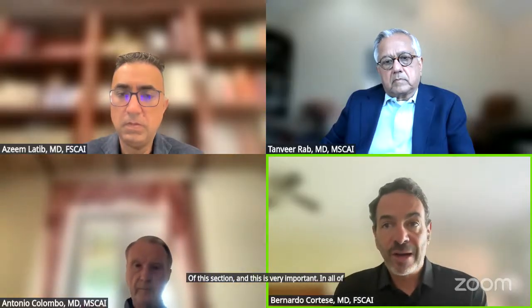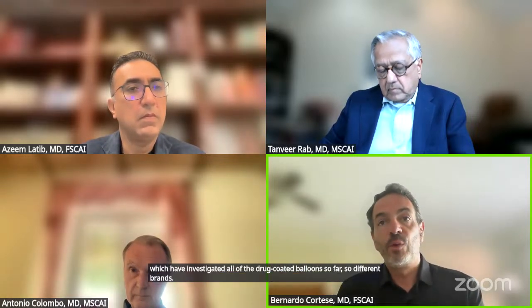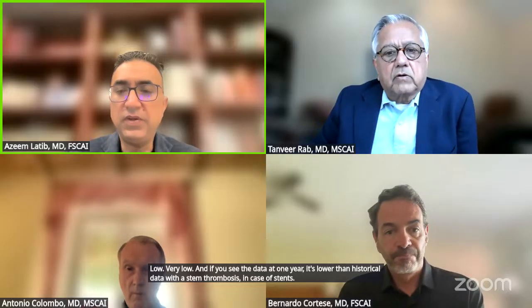And this is very important. In all of the clinical trials, which have investigated all of the drug-coated balloons so far, so different brands with angiographic or clinical follow-up, the risk of closure of the vessel is very low, very low. And if you see the data at 1 year, it's lower than historical data with a stent thrombosis in case of stents.